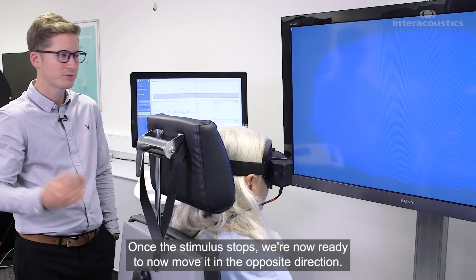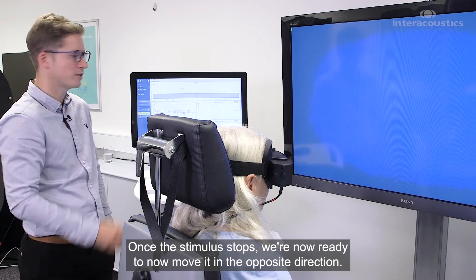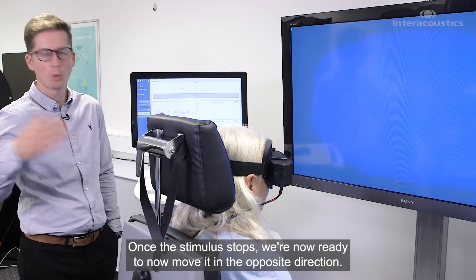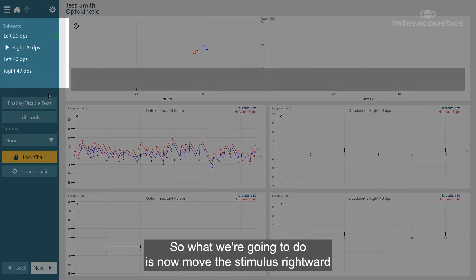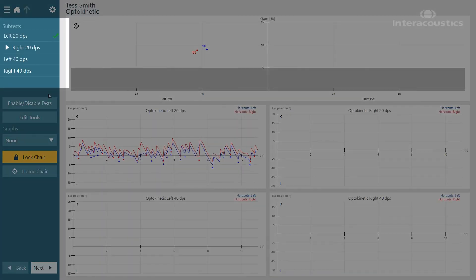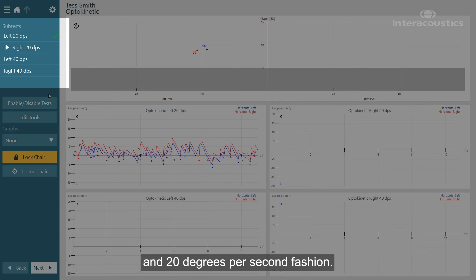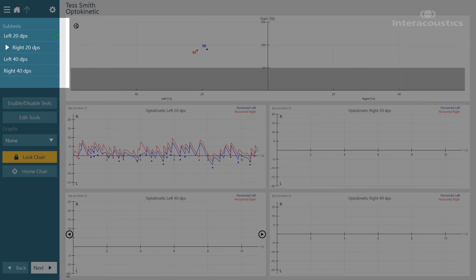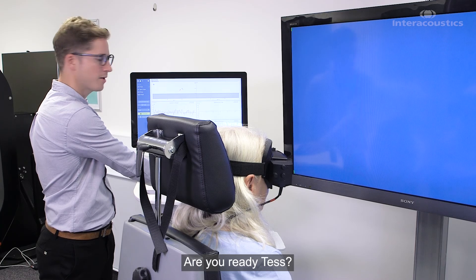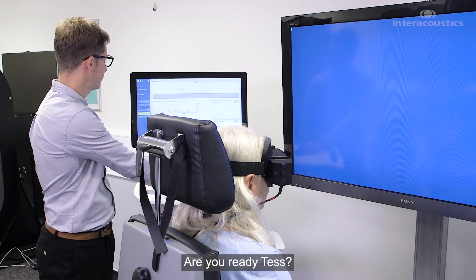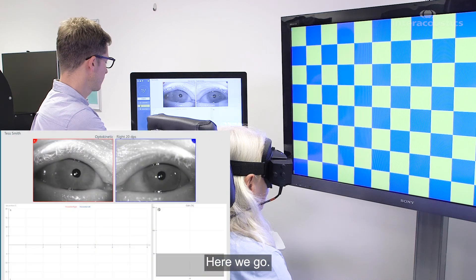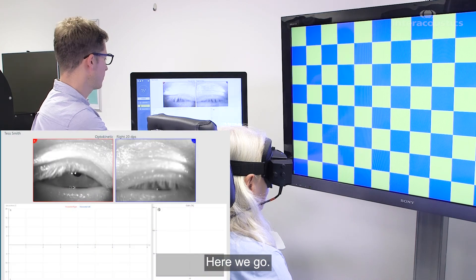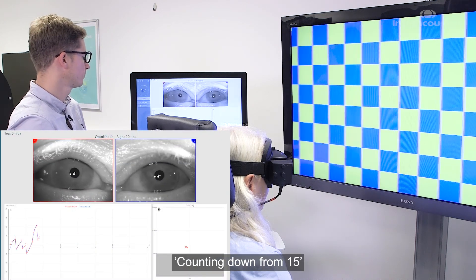Once the stimulus stops, we're now ready to move it in the opposite direction. We're going to move the stimulus rightwards at 20 degrees per second. Are you ready, Tess? Here we go, counting down from 15.